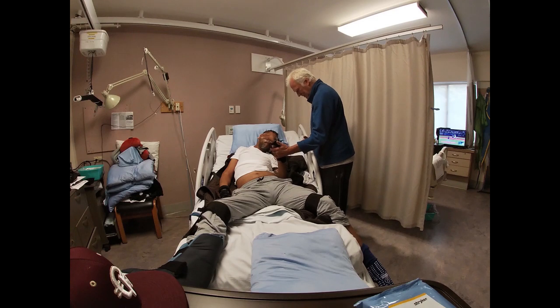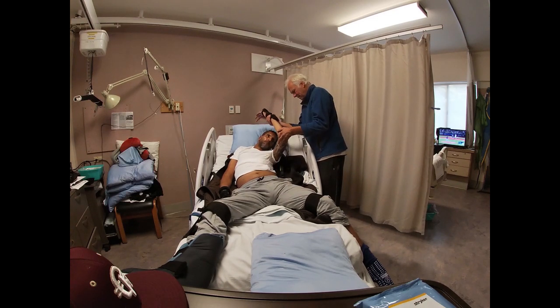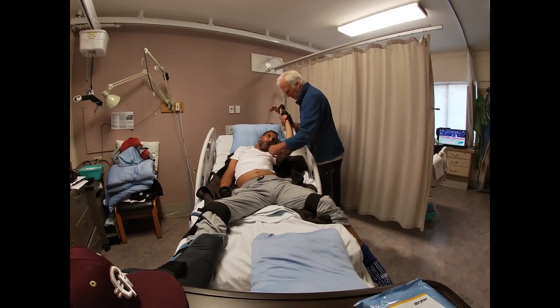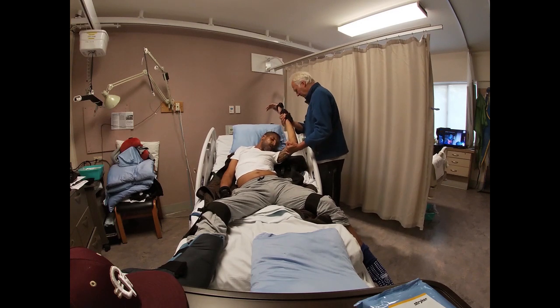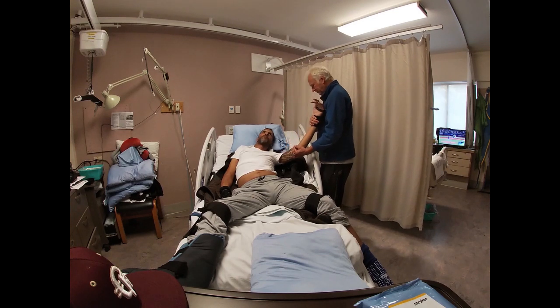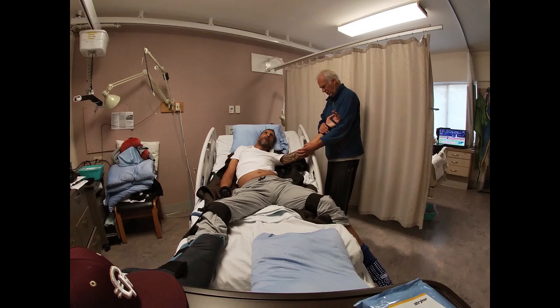Good, good. And we're going to bring it up here like this. Where do you feel the tension here? Pectoral muscle? Pectoral and shoulder. The shoulder, where? Back of the shoulder or the top of the front? Top of the front. Is it a strong sensation, or tearing, or burning, or what's going on? Just stretching right now. This feels super tight. The other side almost felt worse. Is that right?